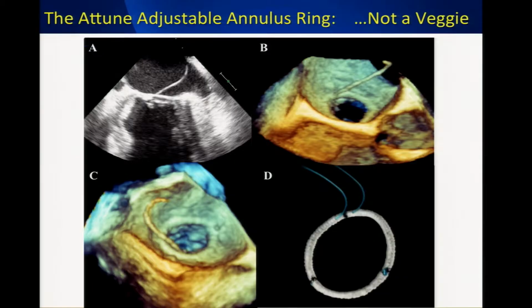Again, what was the surgery? This is the ring, this is the suture, and somehow this was thankfully from another center. We think the surgeon just didn't know what they were supposed to do with this, and they cut one off and they left the other one. So the ring was sewn in, mismanaged, and now you have this long linear thing, which is a piece of prosthetic material. It's causing no harm, still there, but it confuses every echocardiographer who looks at this patient's studies forever. So that's just the point of prosthetic material: trying to differentiate, and doing a little digging, finding out what happened, what it's supposed to look like.